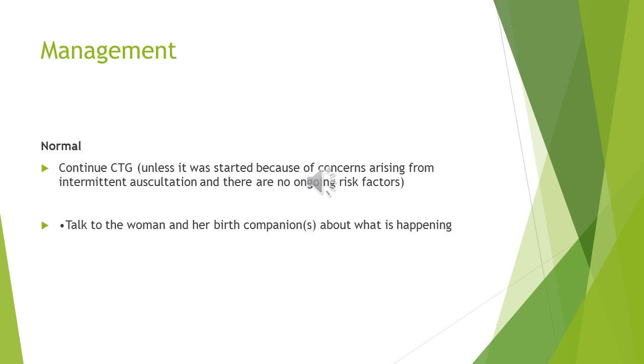becomes normal for 20 to 30 minutes, then the patient can return back to intermittent auscultation and there is no need to continuously monitor the fetal heart. And then you have to inform the woman and her birth companion about what's happening. Remember, communication is very important.